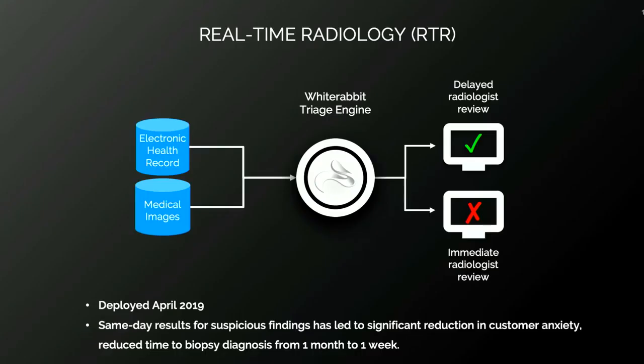This triage engine is responsible for ingestion of images, filtering out images in cases we cannot handle, but also running inference against the images for each patient. And it will output one of two things. One, maybe the patient has a suspicious set of images, and with that information, we will elevate it on the radiologist queue. Radiologists have task queues, very similar to software, called work lists, which are just queues of patient cases with all the associated data they need to actually make a determination.